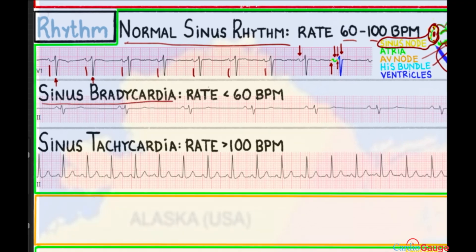Sinus bradycardia is just sinus rhythm with a rate less than 60 beats per minute — you can see this is a slow rate. Sinus tachycardia has a rate greater than 100 beats per minute. Here the distance between QRS complexes is a little less than three boxes, so the rate is probably around 110 beats per minute.